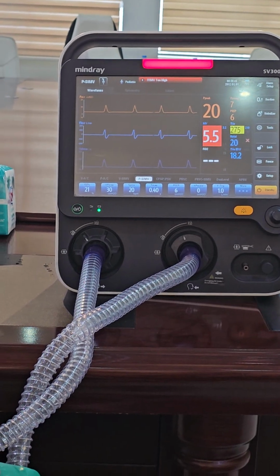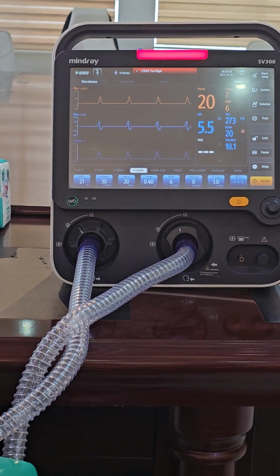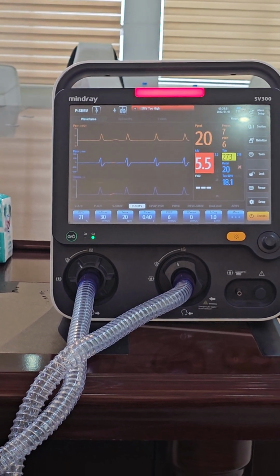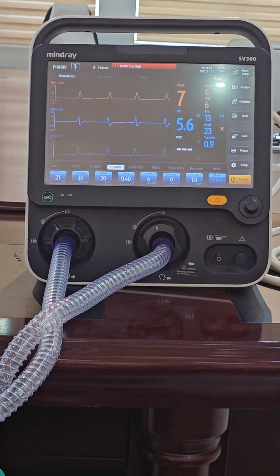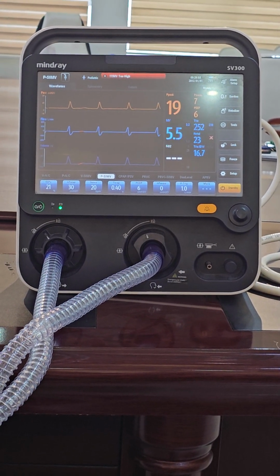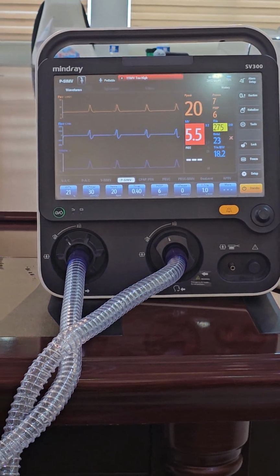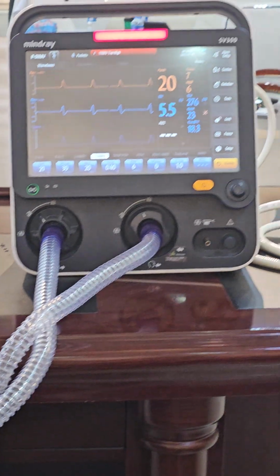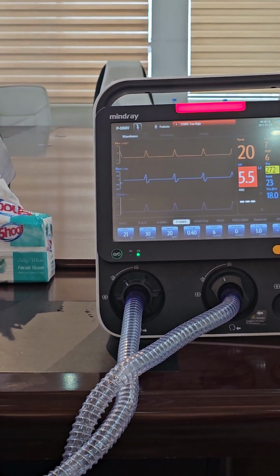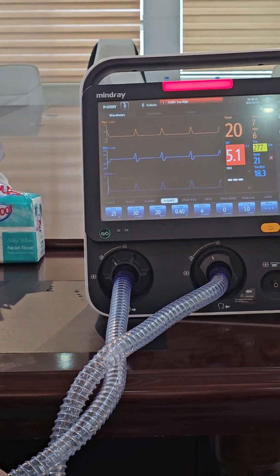Let's say the patient is on intermittent mandatory. How many types of breath will you see? Of the three, which ones? Mandatory and spontaneous. You will not see assisted. So let's say the rate is 30 and the patient is breathing 60. How much will the rate be in intermittent mandatory? It will be 30. It will not be supported, so it's more difficult on the patient. Now let's say the patient has low CO2 and is breathing 60 while on SIMV the rate is 30. Which one will wash out more CO2, the rate high or the rate low? High.